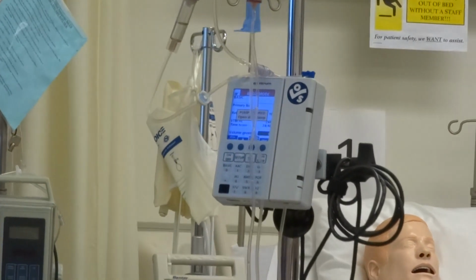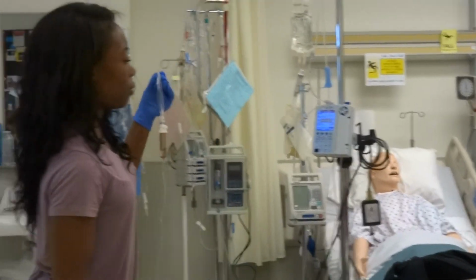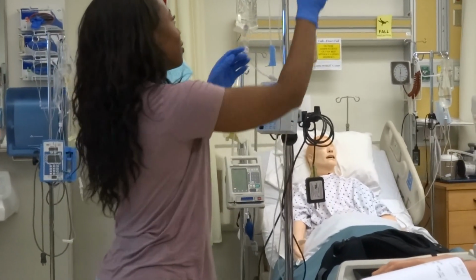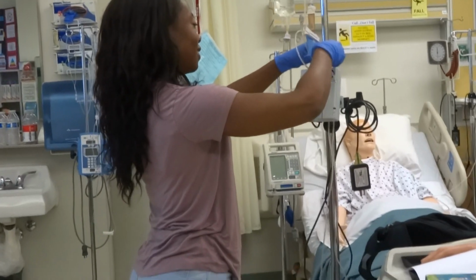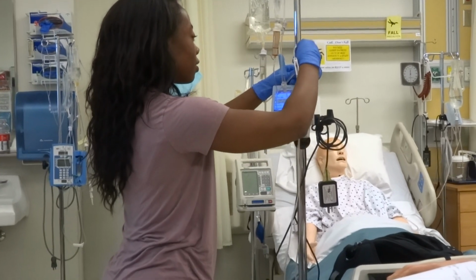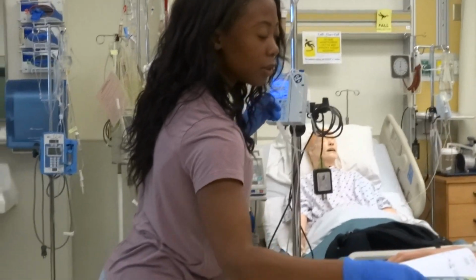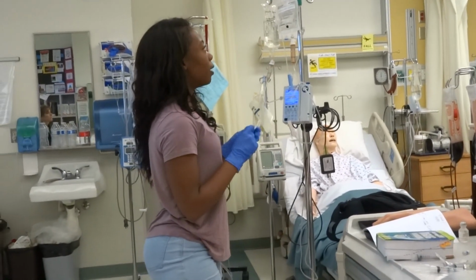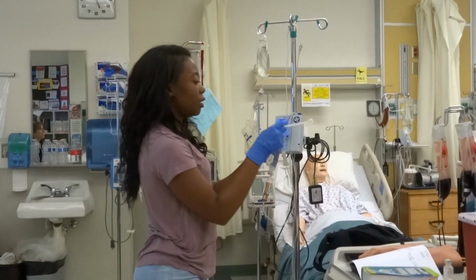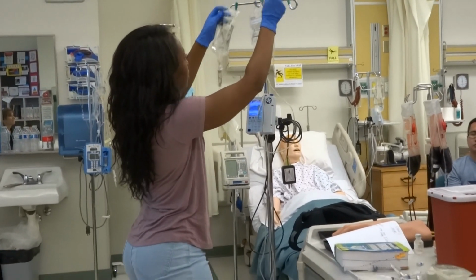What's my next step? Okay. For back priming, just hold it low like this. Oops. Well, I should probably attach the right one first. I'm like, oh no. Do you lower that bag now or after you back prime? Okay, yeah, you can lower it now actually. So the secondary bag comes with this, not the primary. As was being said, you're gonna lower this only because by gravity, I need this one to pull first. I lower this one, right?